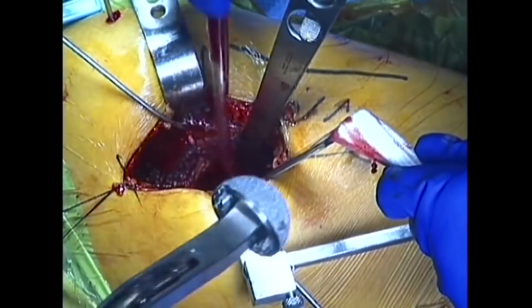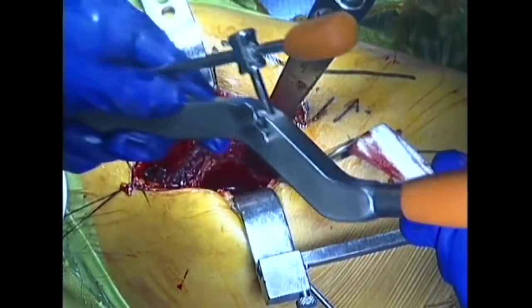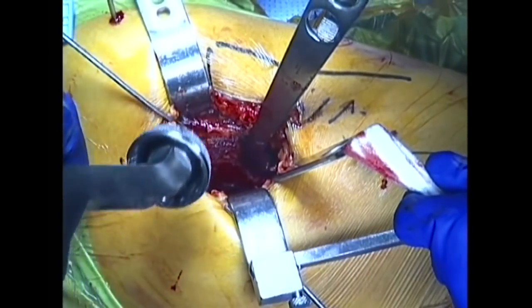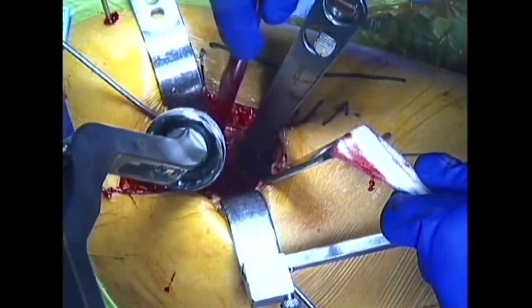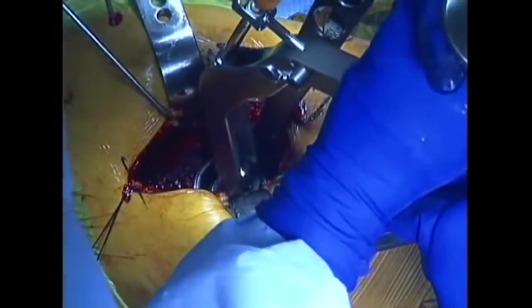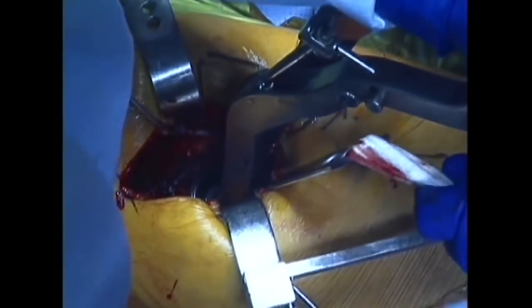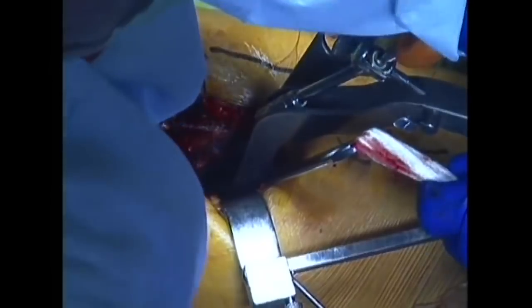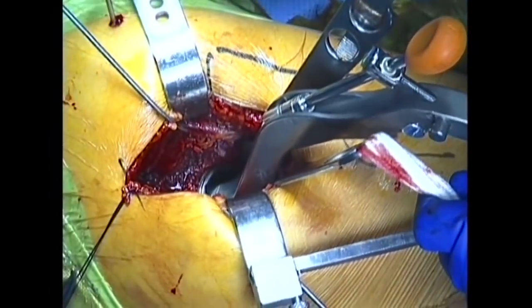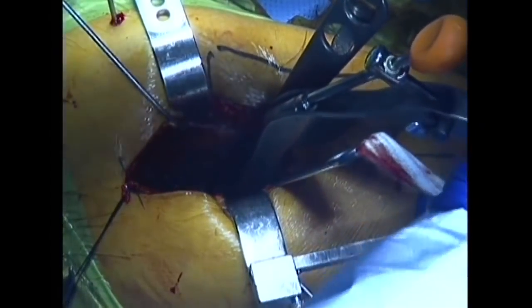After the socket is prepared, the metallic cup is pressed fit into place and impacted securely. The exterior of the cup is porous, allowing an ingrowth of bone to secure the cup. An alignment guide is placed and used to ensure proper alignment of the cup.